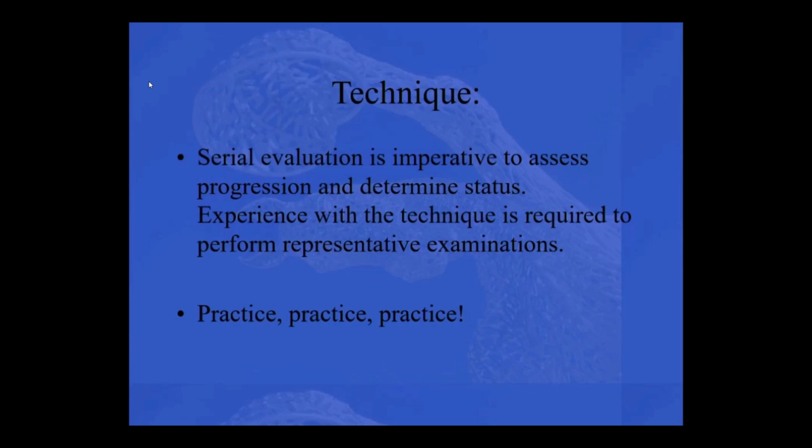I would say if you're interested in using power Doppler, don't do it just once, because then you get a bit lost in what you're seeing. If you think it's a good tool for you, start to do it a lot, practice, practice, practice. It's only 5 minutes more, maybe not even on a standard exam, and it gives you so much more information later.